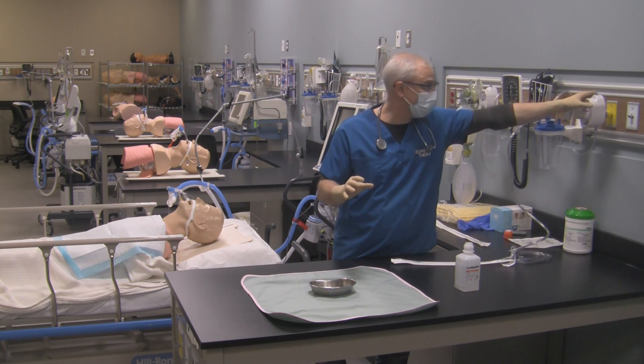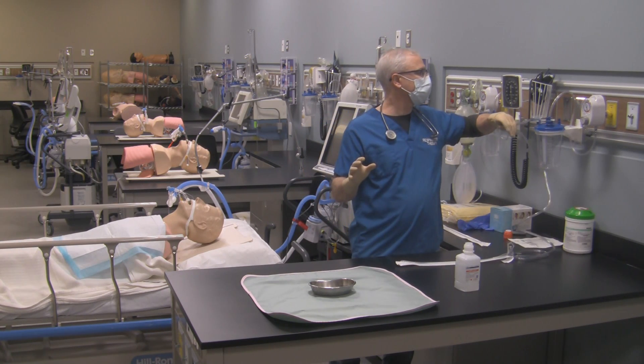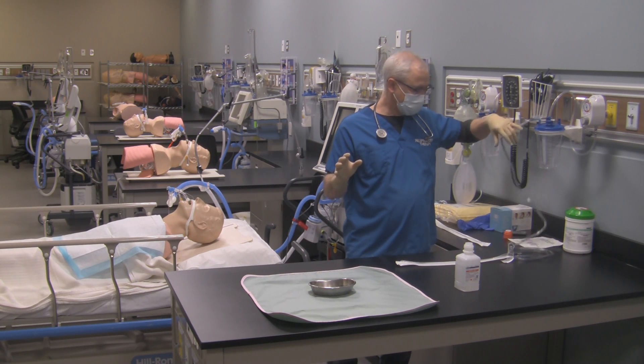Now I'm taking my hand, placing it on the suction regulator, turning it on and occluding the tubing to see that I've got the correct pressure — and I still do. It's minus 120 millimeters of mercury.